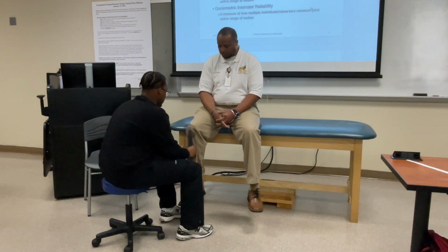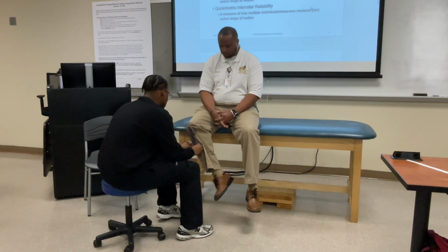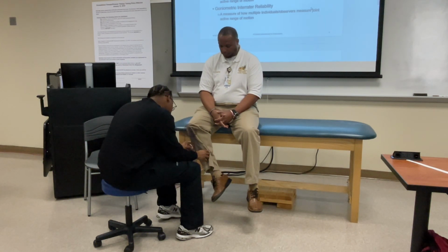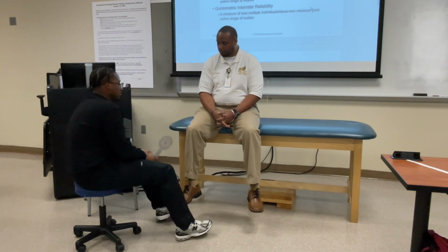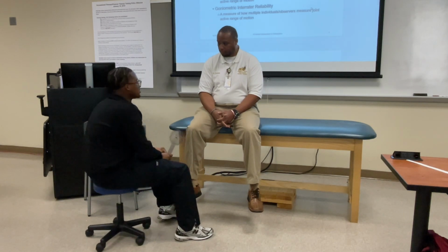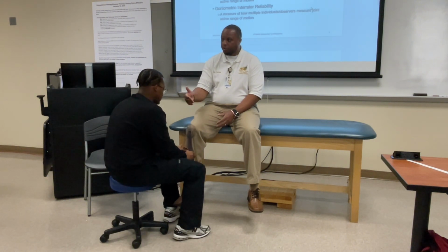All right. So where you can do that movement. Thank you. You're at 25 degrees external rotation. Okay, do it again. And I want y'all to pay attention. If y'all want to come around and pay attention to his alignment, make sure that his alignment is staying the same. Make sure his stationary arm is not moving, because if your stationary arm is moving, it's going to throw your measurement off.